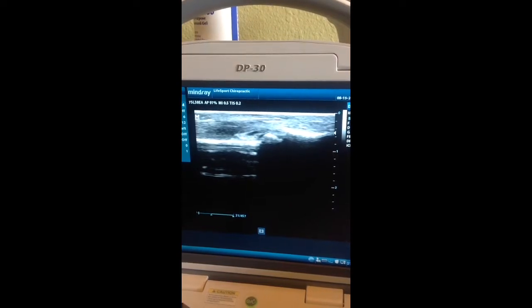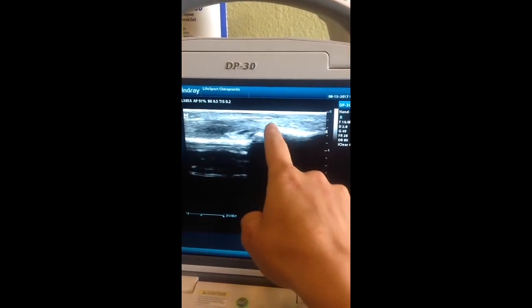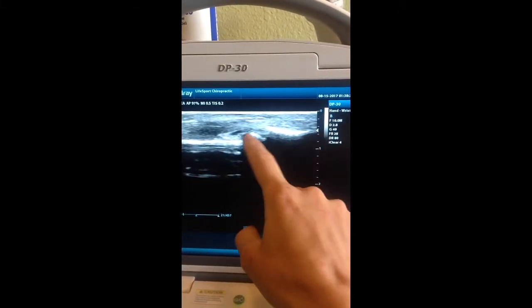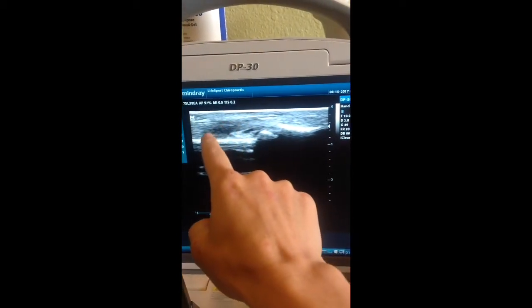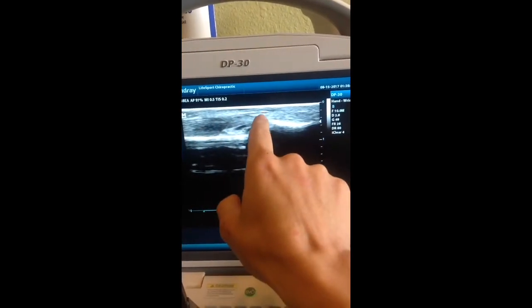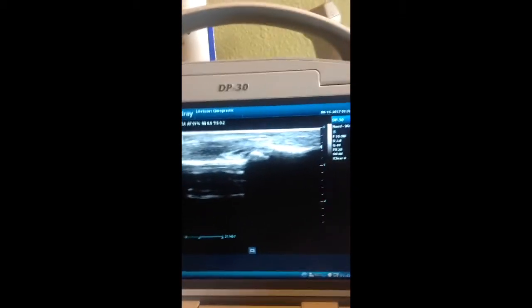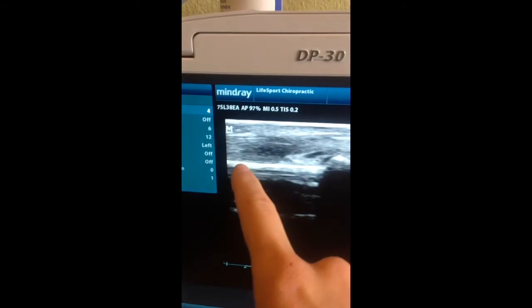As we were discussing with the finger, we can very clearly see the surface of the bone, the next surface of the bone, the joint line itself, and then all of these fibers of tissue that come in and attach. Here we have one of our flexor tendons attaching on the bone. We can see the white lines of the fascia that reinforce the tendon, and then we can zoom in and see the attachment on the bone and make sure that it is nice and smooth.